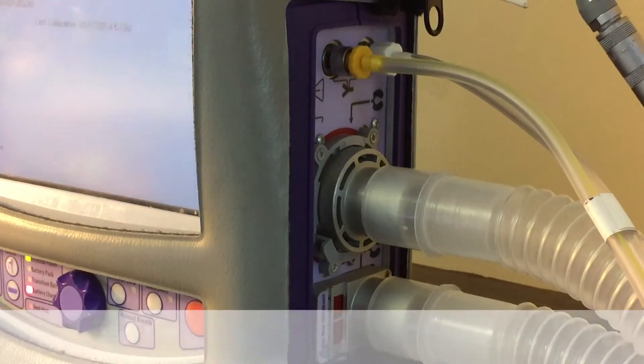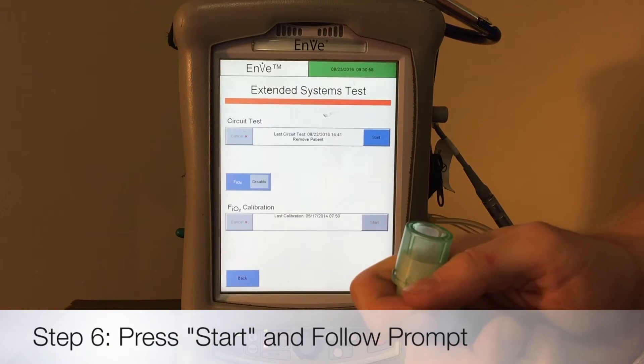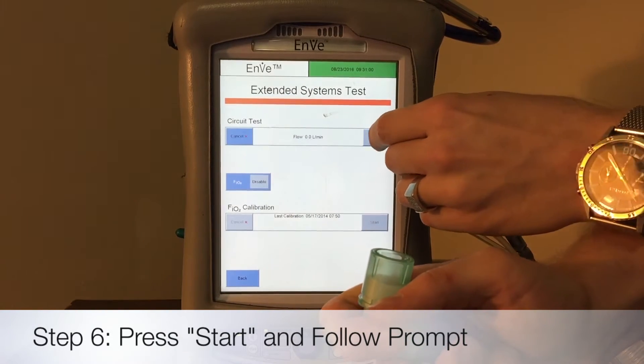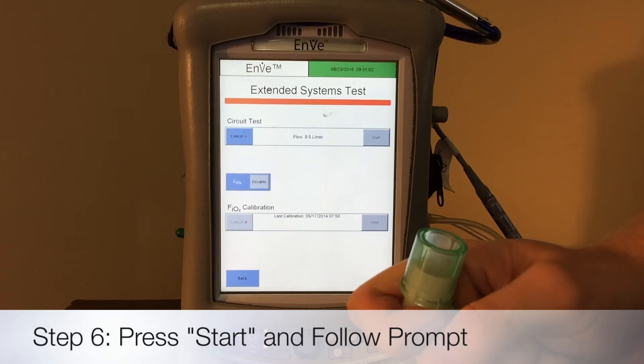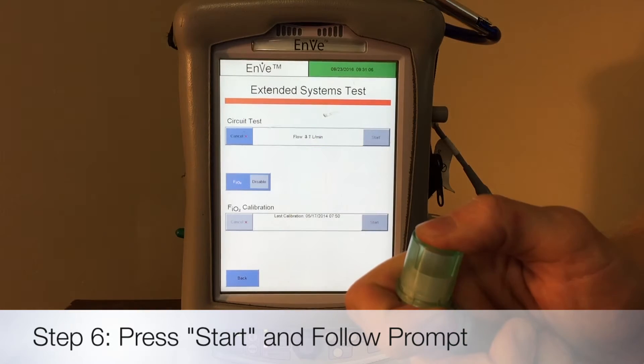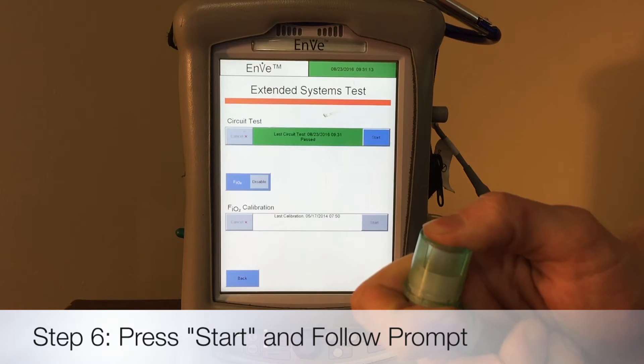So now that it's tightened and attached, you can go back to that screen. You'll notice the countdown is done and be ready to occlude it. So we hit start and the vent ramps up. You can hear the blower going and then we occlude it and then it's going to pressurize the circuit and look for any leaks. So we keep our finger on there and it has passed.